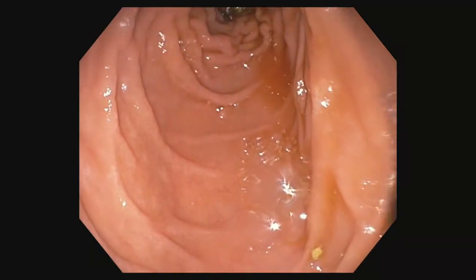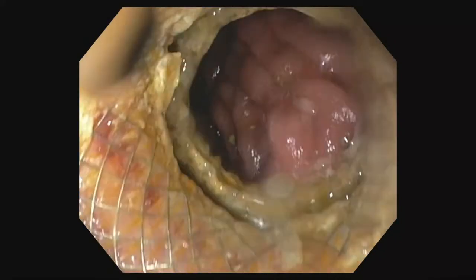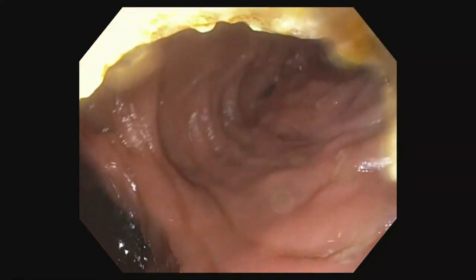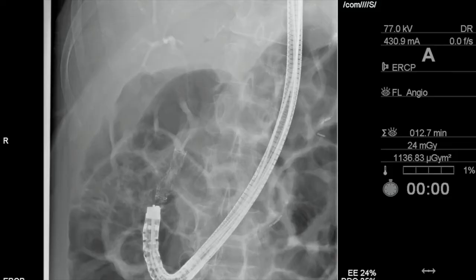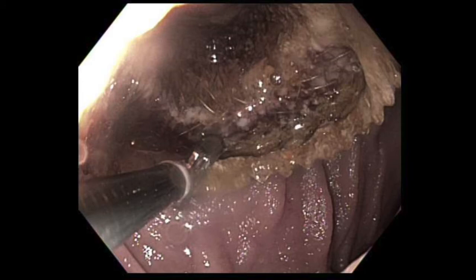Six weeks later, the patient underwent repeat endoscopy. Using a gastroscope, the LAMS was traversed and the bile duct deeply cannulated. Cholangiogram and balloon sweeps were unremarkable. The fully covered self-expandable metal stent was removed from the common bile duct. The gastroscope was then reintroduced and the LAMS was removed with a rat-toothed forceps.